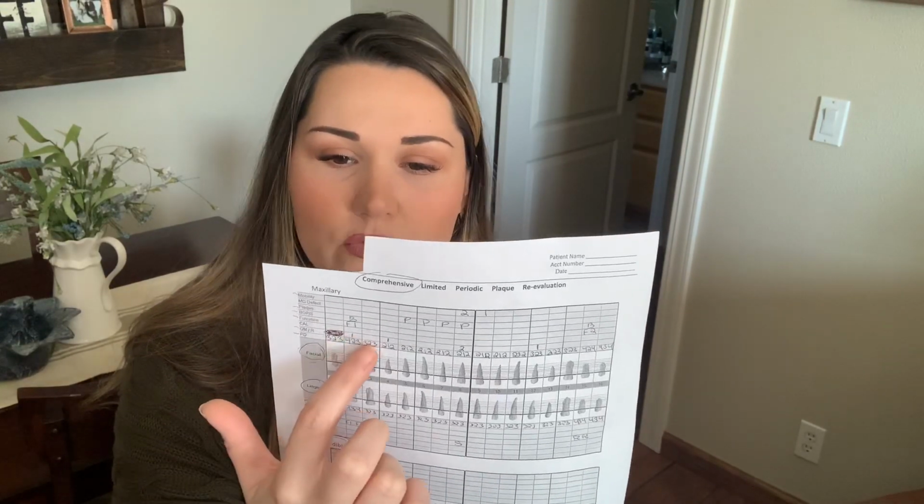So, I don't think I've ever heard of a 0. So maybe it's just 1 to 12. But a healthy gum reading is 1 to 3. So most commonly it's going to be 3, 2, 3. Maybe some 4s thrown in there if someone hasn't had a cleaning in a while, or if they have some plaque buildup. But mostly she's going to say tooth number 1, 3, 2, 3, 3, 2, 3, 3, 2, 3, 3, 2, 3.